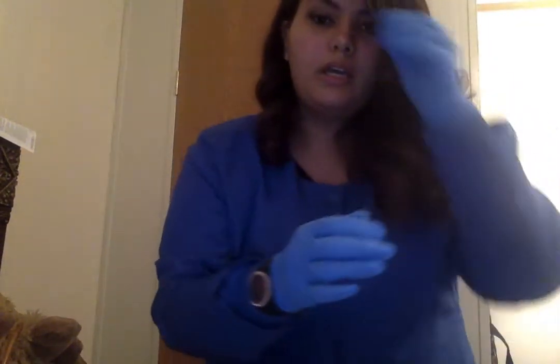So now what we're going to do is we're going to empty the drainage bag. We don't want urine everywhere, so we're going to empty the drainage bag. We're going to measure it, and we're going to record the amount that came out of the catheter bag. So now we are going to remove the catheter.